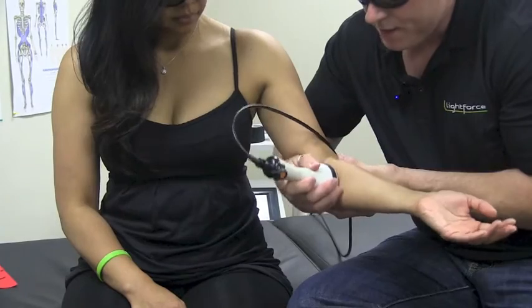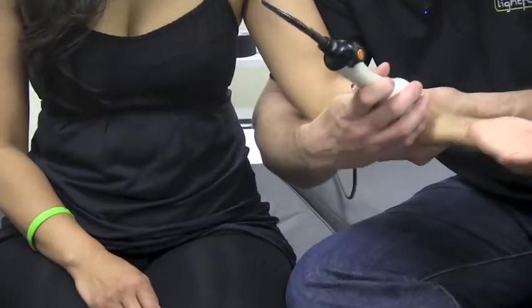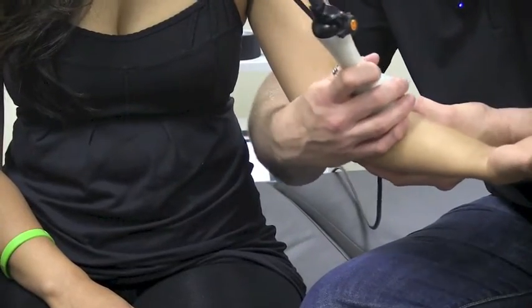Now I can move this around here, gauge pace and response, and then she's going to go into flexion and extension again. So now I can do the inside.